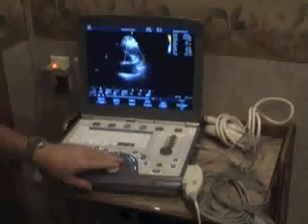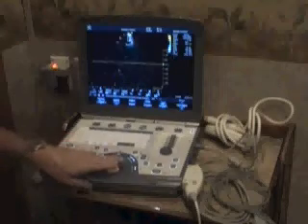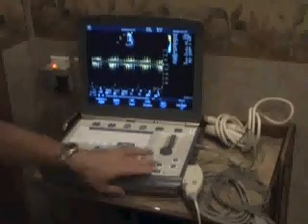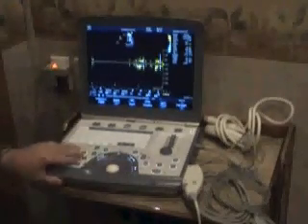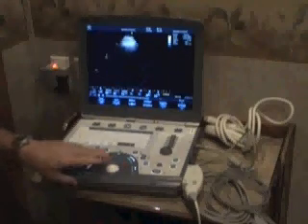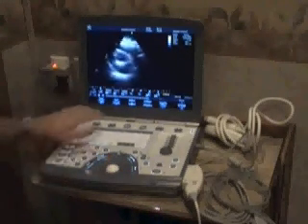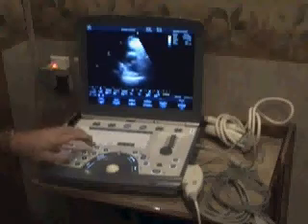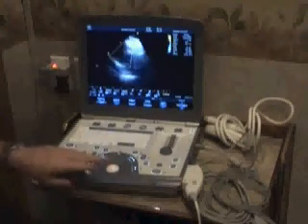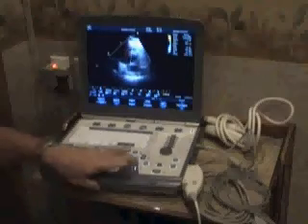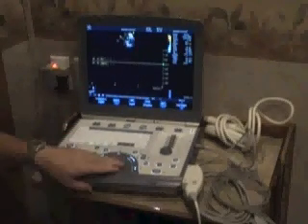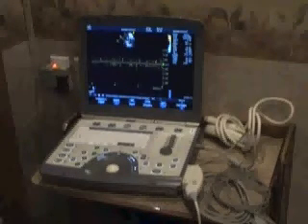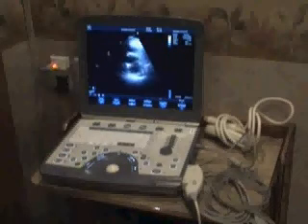We're going to take a picture of the pulmonic artery and the right outflow tract in color. We're going to take what's called a continuous wave Doppler of that pulmonic artery outflow tract. Then we're going to take some color on the right tricuspid and take continuous wave through that side also, to see if we can determine if the tricuspid valve has any leakage. It doesn't show any, so I don't have to show that to the physician.